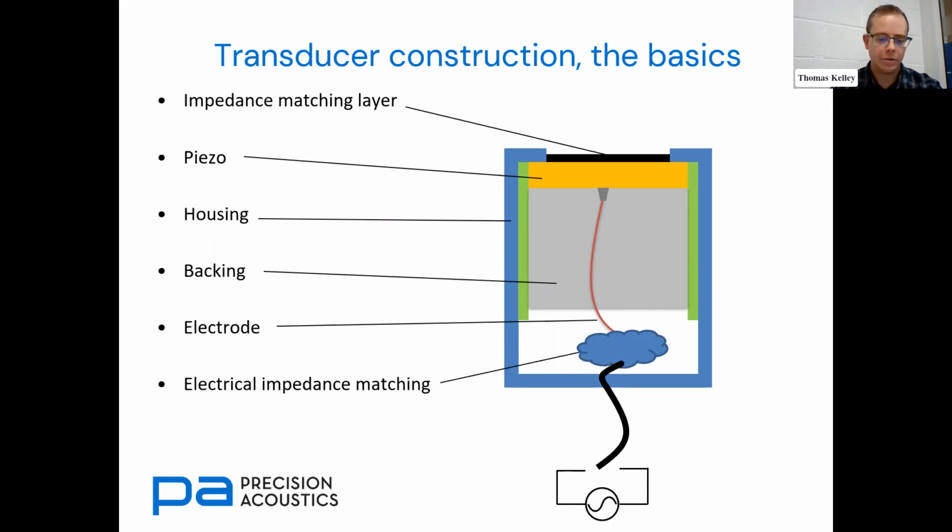And finally, we've got some mechanical and electrical impedance matching in this drawing here. And we're going to go through the functions of all of these parts in some of the slides to follow.